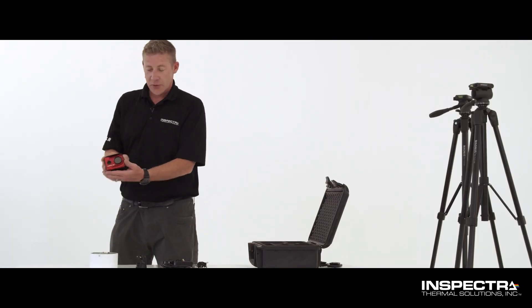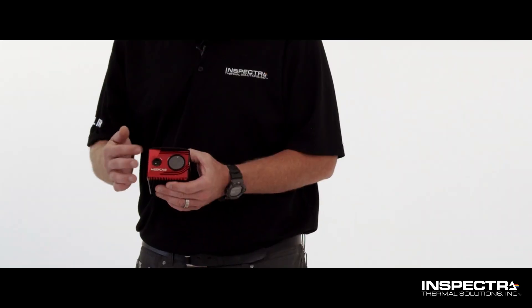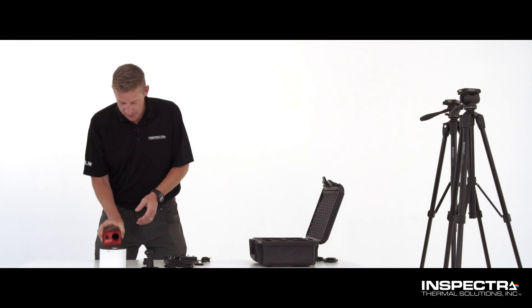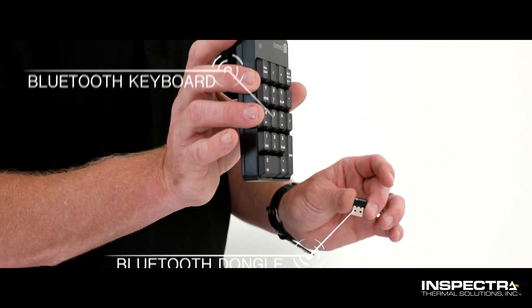The first, probably the most important part, is our thermal imaging camera. We have a thermal camera here and an optical 1080 camera here, so you'll have both views once you get it set up. We also have our Bluetooth keypad. This will plug into the back of the camera system and this will be your control for that.